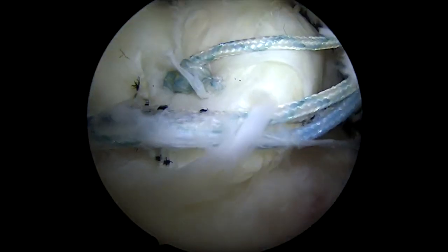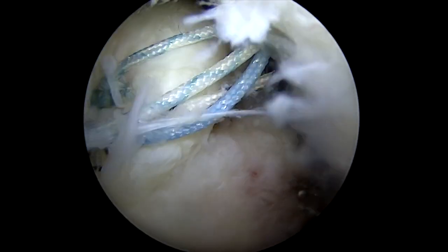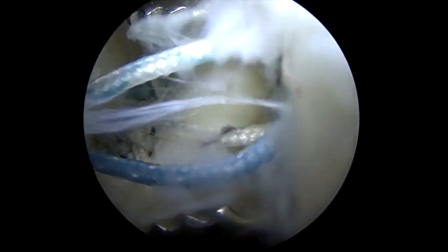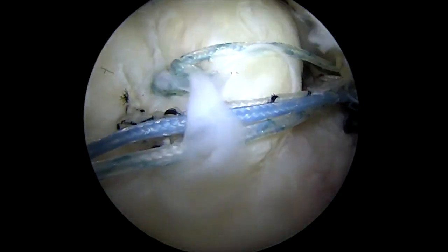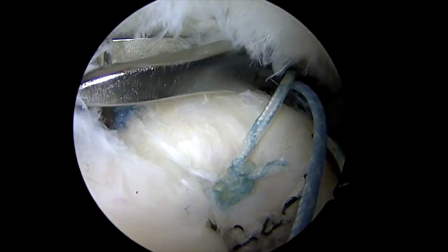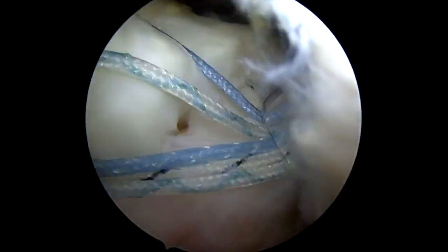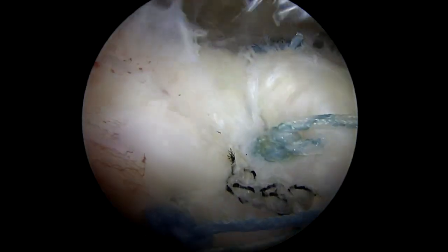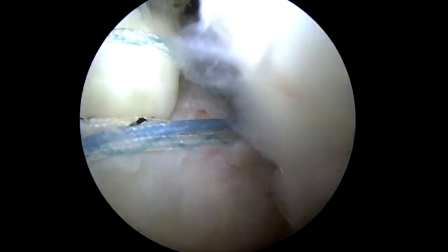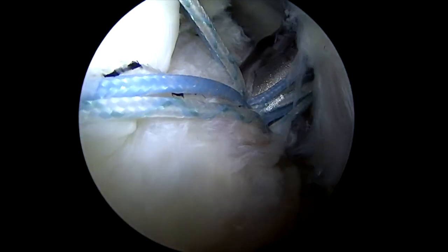Once those are all tied, the tendon is completely covering the footprint. Now I can bring the sutures into my lateral row anchor and get those all compressed. We grasp those out the lateral row one by one, and once those are all grasped, we'll use the cannula to see what it's going to look like depending on where I place it — that's going to look pretty good if I go there. So that gets me a preliminary idea of whether or not that's going to be an appropriate position for our lateral row anchor. We'll tap for that anchor and then place the anchor itself.